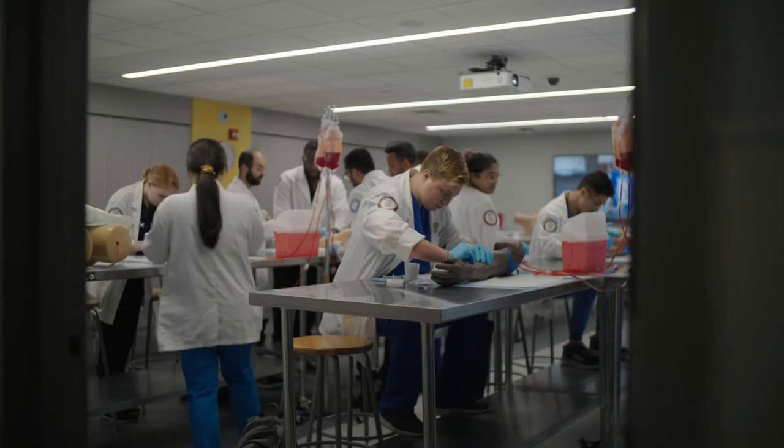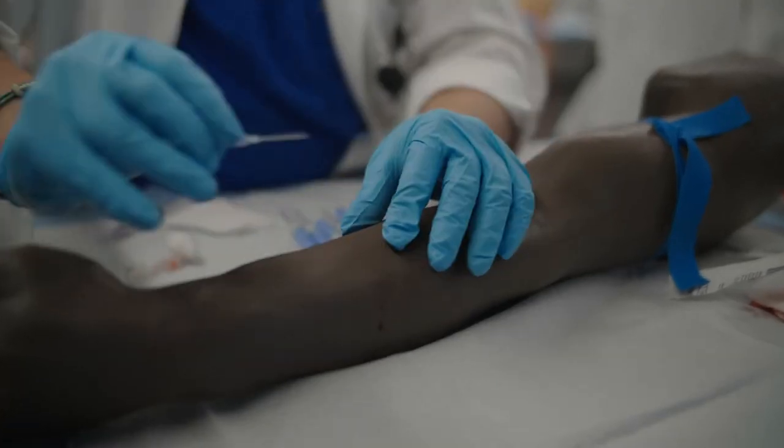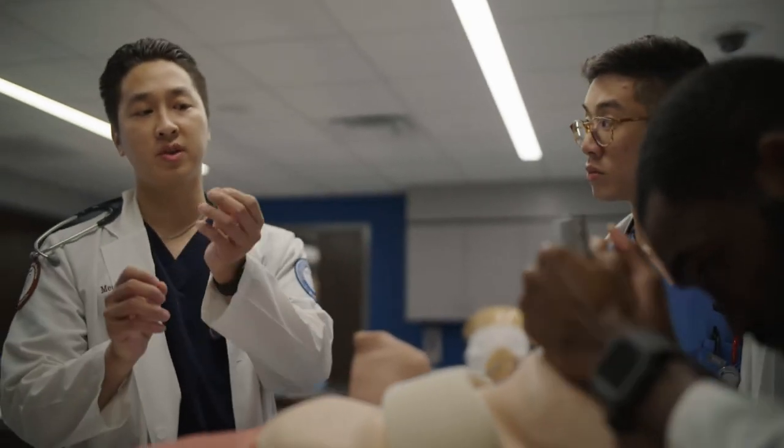One of the values of simulation is the fact that although a student must master the various skills, they get the pass of not having to deal with the stress of a real life. Learning how to put in an IV or draw blood, nobody wants to actually inflict pain on anybody. So I think that it provides for a more fruitful learning experience for them. When you're inserting it, hold from like the base.